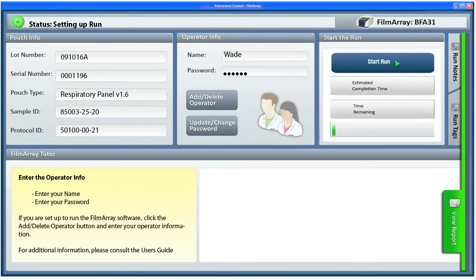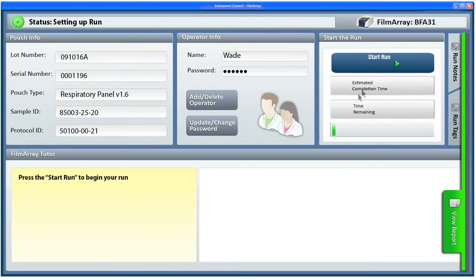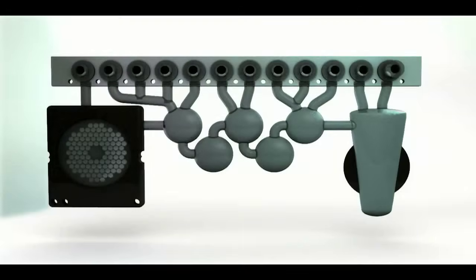You are free to walk away since all remaining steps are completely automated. The FilmArray displays the remaining time. Now let's take a look at what happens inside the pouch.